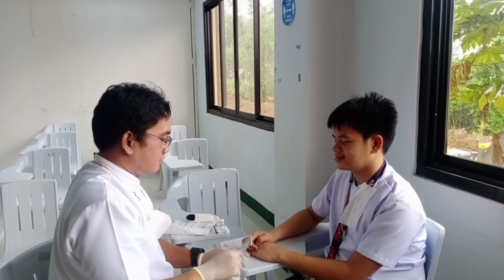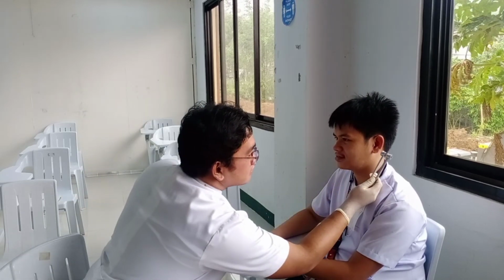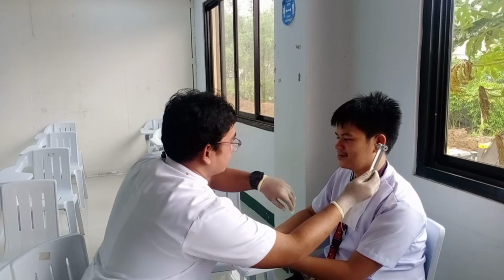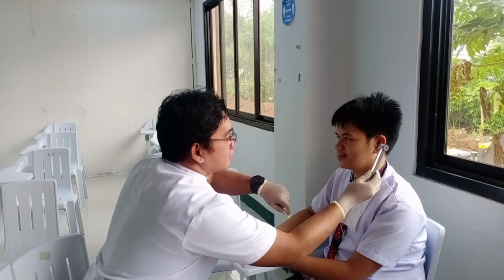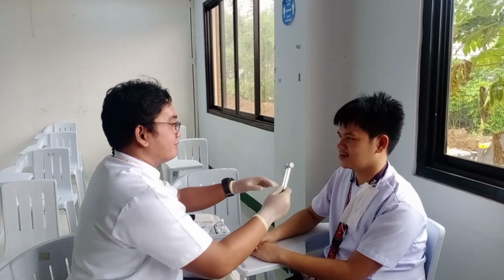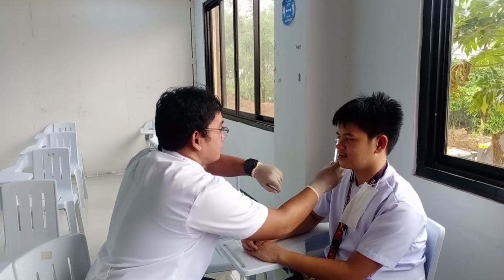Strike the tuning fork again and place it about 1 inch away from the client's ear and measure the time until the client can no longer hear the vibration. Air conduction should be greater than bone conduction. Repeat it on the other ear. This is to evaluate each ear separately.